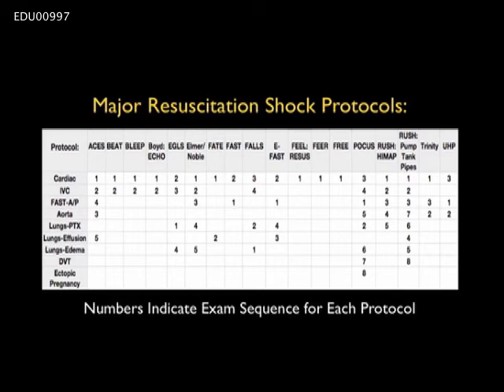The RUSH exam is therefore an easily remembered ultrasound protocol for the assessment of the patient in shock that utilizes the mnemonic of pump, tank, and pipes to incorporate many ultrasound elements into an evaluation. Here's a table that encompasses many of the major resuscitation shock protocols that have been published to date, and we see them across the top of the table. Let's look specifically at the RUSH pump, tank, pipes protocol.